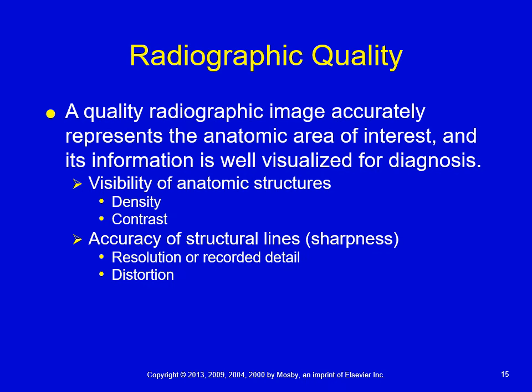So now we're moving on to the topic of radiographic quality. So you as a technologist, when you are out in the field, with each image that you take, you want to ask yourself, is it a good image? Is this image good enough for me to send on to the radiologist for the patient's diagnosis? Or do I need to repeat the image because it's of poor quality, it's non-diagnostic?